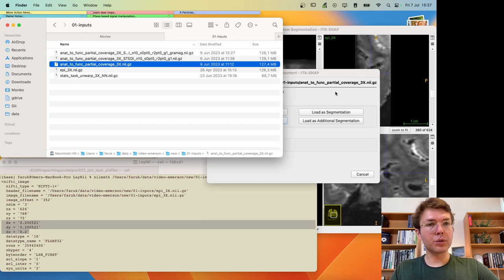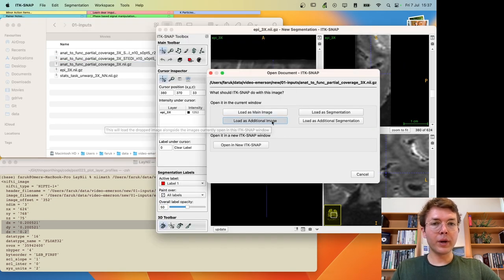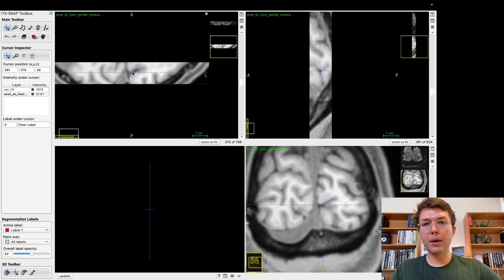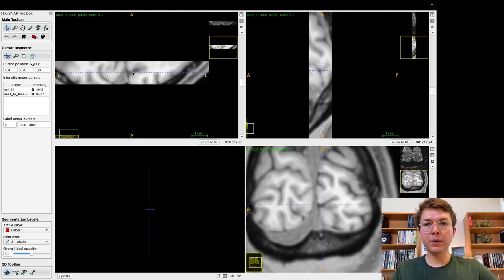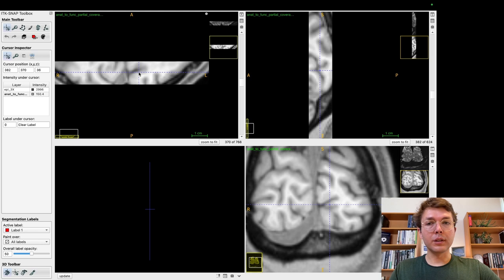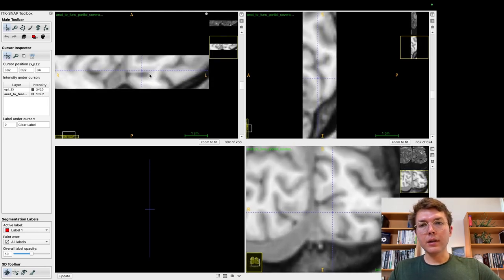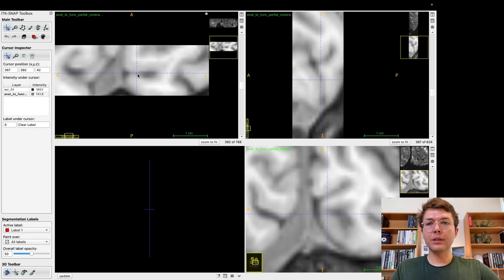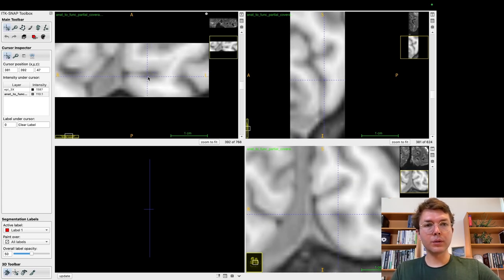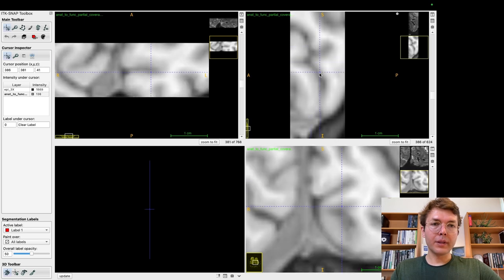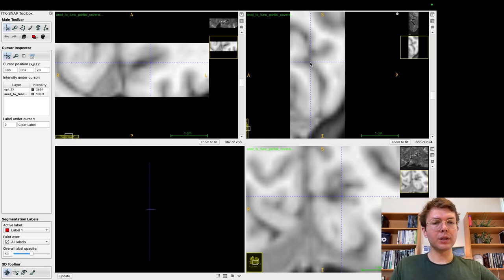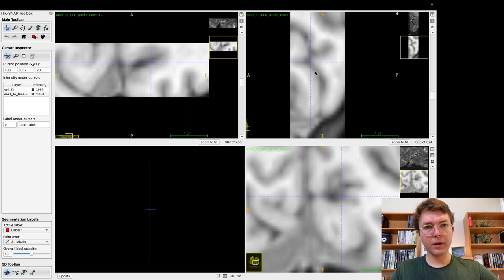The second image is the T1-weighted dataset that is already nicely registered on top of the EPI image. I'm just using what Joe sent me, resampled a bit, and taking it as a good enough registration for the region of interest. This is an upsampled T1-weighted image registered to EPI space and then upsampled to 0.2 millimeter isotropic resolution. You can see there are quite a few interpolation artifacts — when you upsample you can choose your interpolation method, and here I used cubic interpolation.